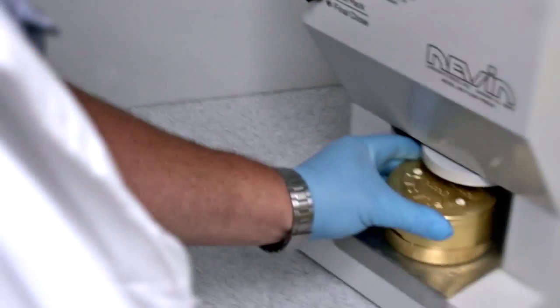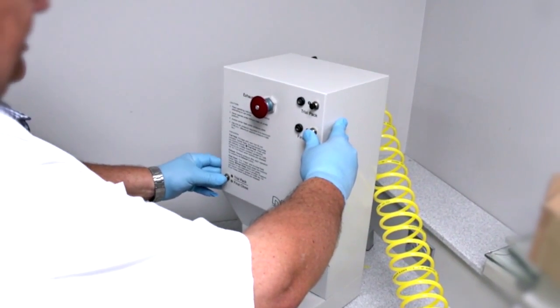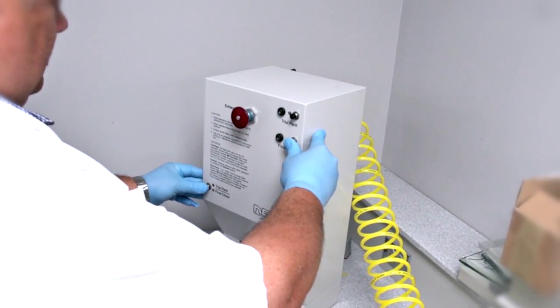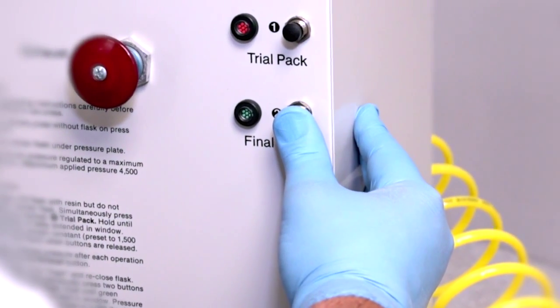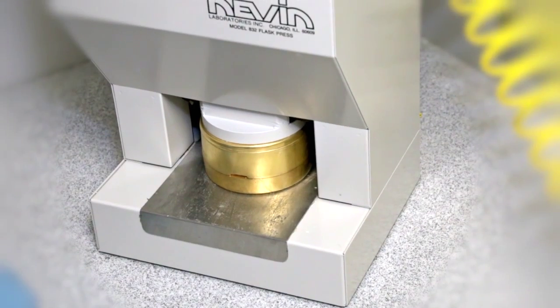Getting the final closure. Center of the flask. I'm going to press button number 2, and then the same first button down here, which is also button number 2. Give it a minute, exhaust it, we're ready to cure it.